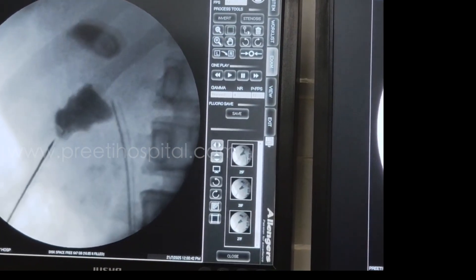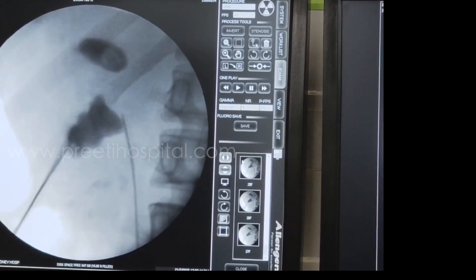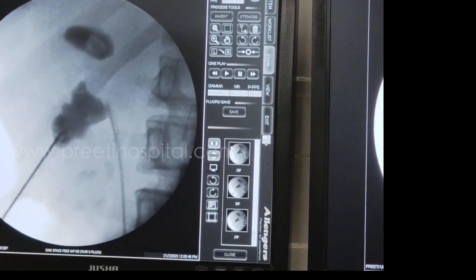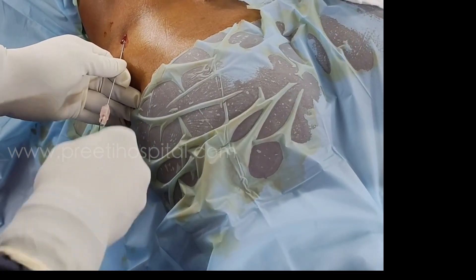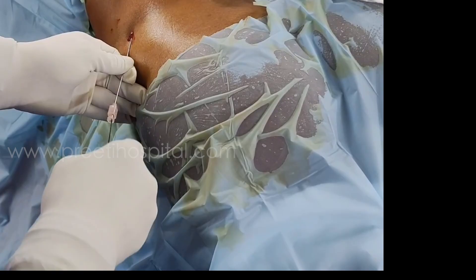And he will feel the stone. See, it is moving. With that loss of resistance you can see on C-arm also. And he sees it, and immediately urine comes. This is monoplanar technique where you need not change the C-arm.